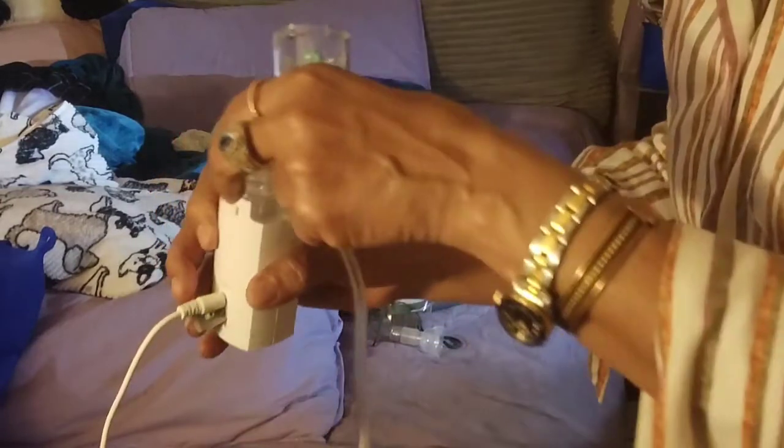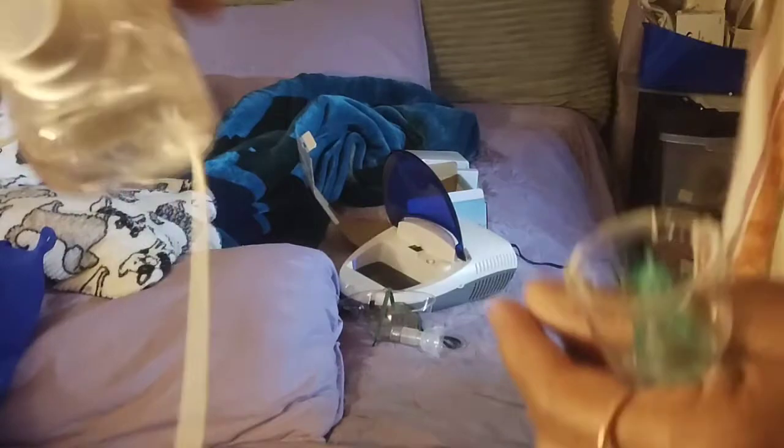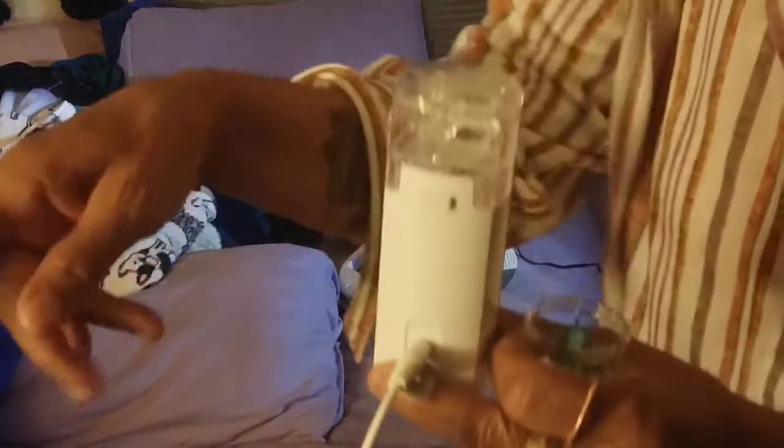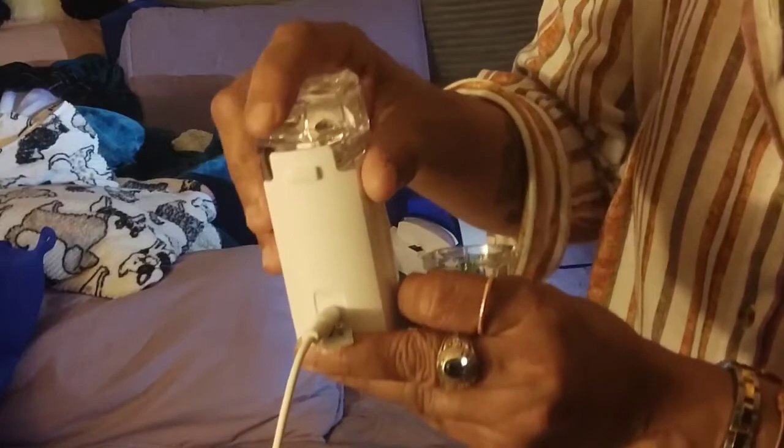Okay, I'm just going to take the liquid from here. You snap it. There is no leaking, guys. You don't have to be afraid of leaking. It's not going to leak anywhere. So I'm going to use the rest of this liquid. And you know what you do? You take an alcohol swab again and wipe it around, just let it air out, and then you close it and put it away. Okay, guys? That's how you sanitize your nebulizing machines.